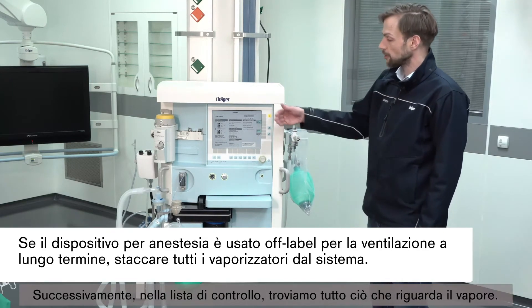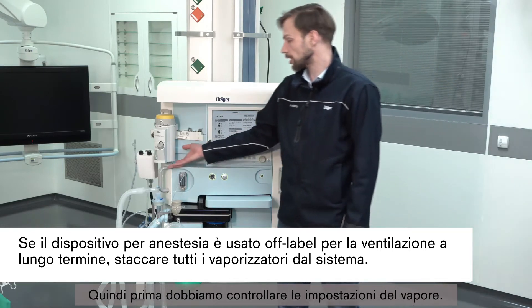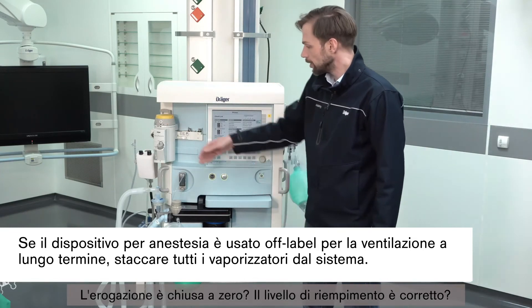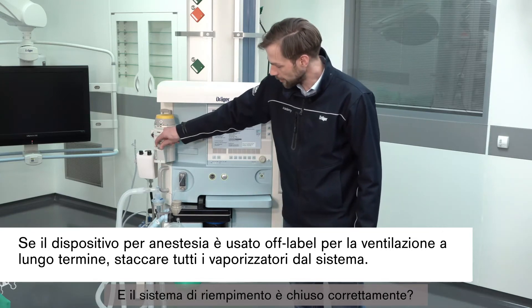Next on the checklist we find everything regarding the vapor. First we should check if the vapor is safely in place. Then: is the vapor set to zero? Is the fill level okay? And is the safety filler correctly locked?